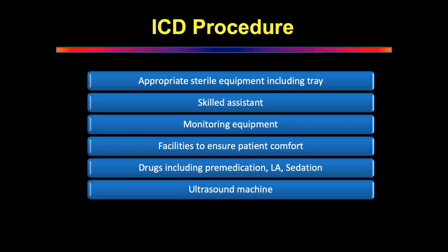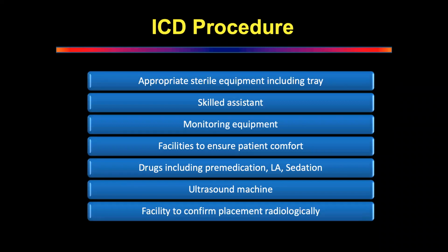Yes, you have to use it yourself. More importantly, what else do you have to make sure? How do you make sure that you have put the chest drain in the correct place? Ultrasound has to be done while doing the procedure. We also need the patient's identity and the chest X-ray. Radiology should be available.